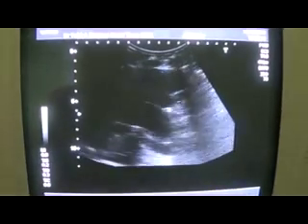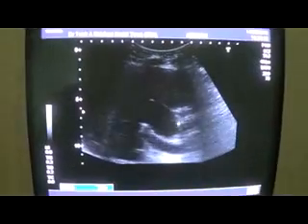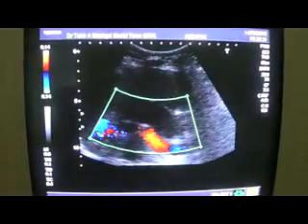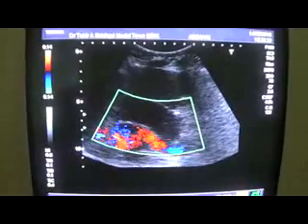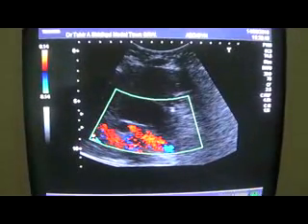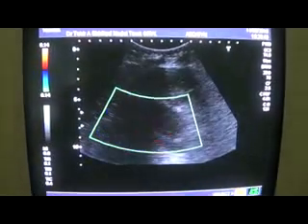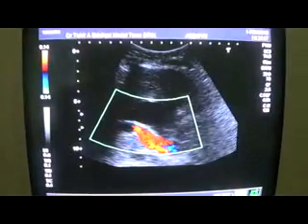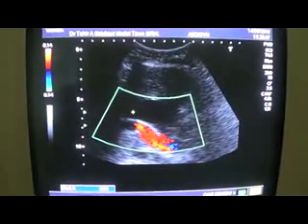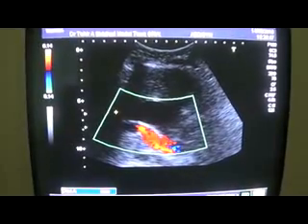It is important to give this information to the surgeon so they can decide the surgical plan. Now, is it really a CBD or some other structure? Is it really a portal vein or some other structure? You can see that this is the portal vein because it shows color on Doppler, with blood flow seen within it. This tubular structure is the common bile duct and we do not see any flow within it — no doubt about that.